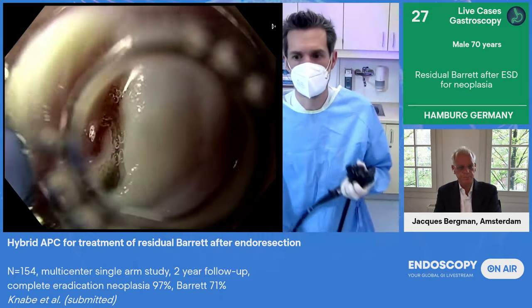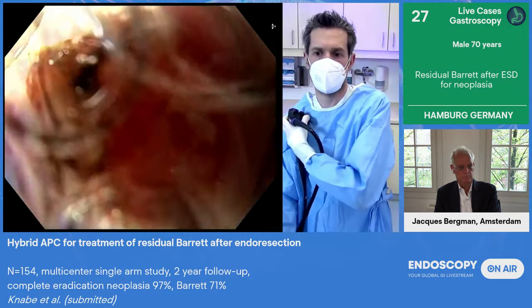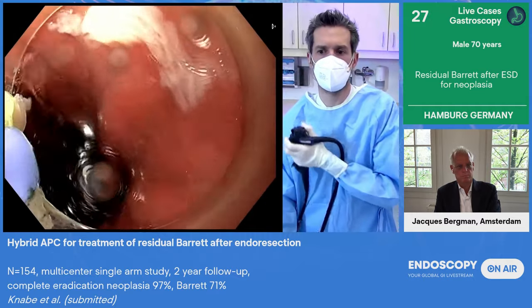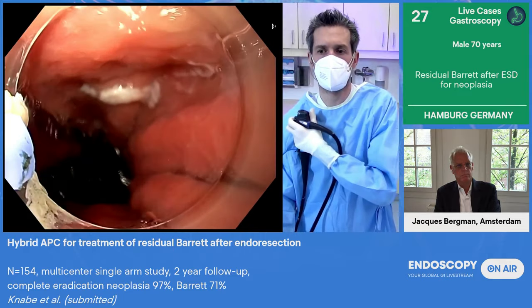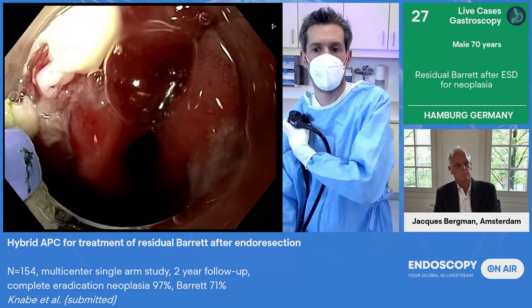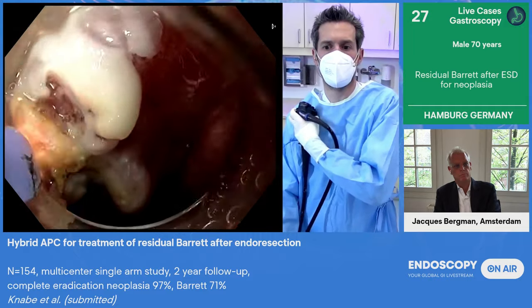On the end of the scar, as you can see, it's more of a fold. So I have to try to reach into that fold, trying to get a little better position. I think there's not enough coagulation there at the moment. If I'm pulling back, it tends to give a plop and then I'm out again. Okay, right here, a little up.